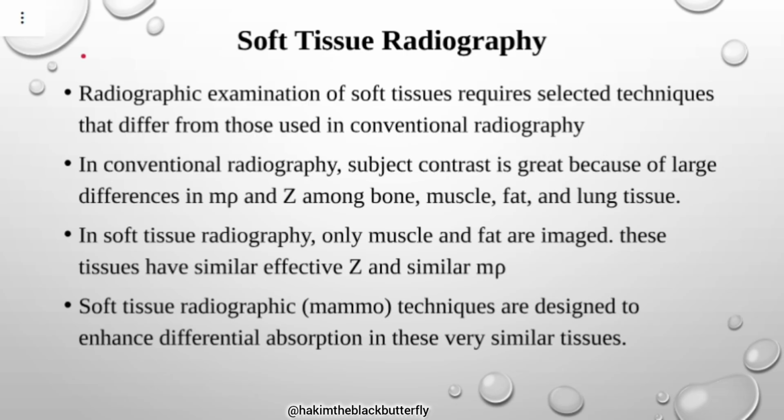So it becomes very difficult for conventional radiography to detect these almost similar densities as different. It can't work with conventional. But with mammography, it is very easy to bring out the differences between muscle, fat, and other tissues within the breast, much as their densities are somewhat close. That's why I said it is a very unique modality.